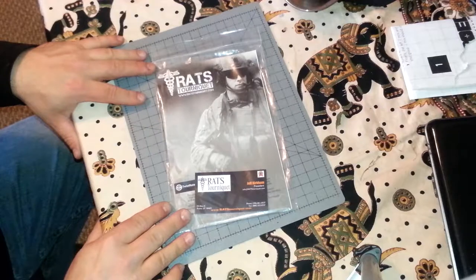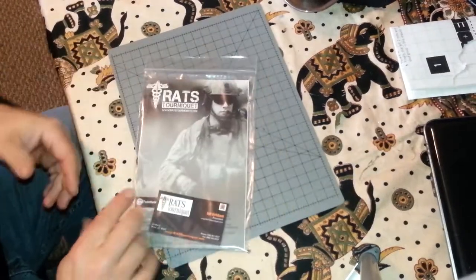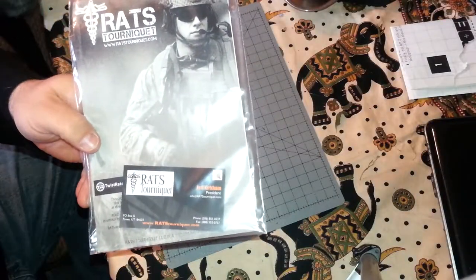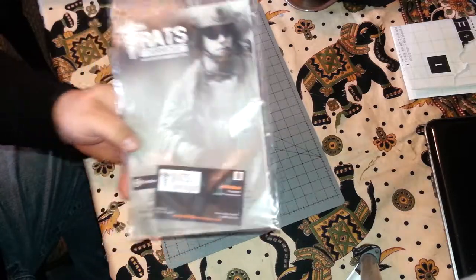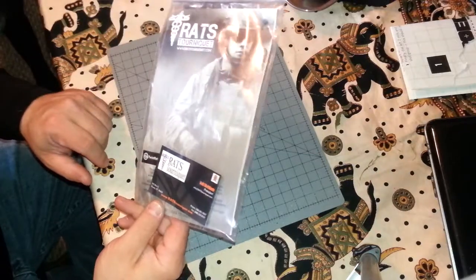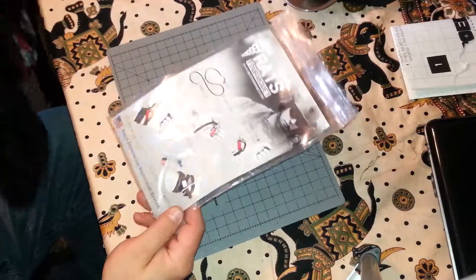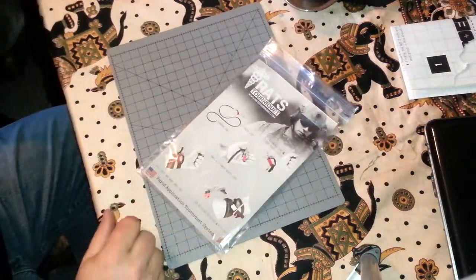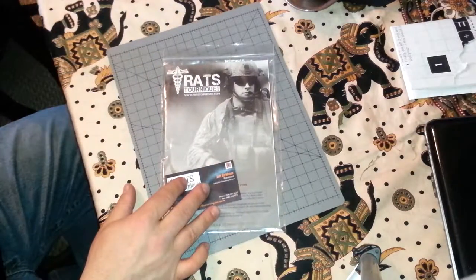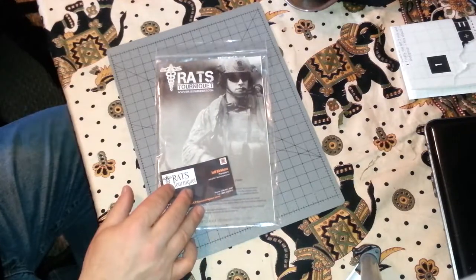I've been waiting patiently — I think three weeks, maybe slightly more — for this. You may not know what a RATS tourniquet is. It stands for Rapid Application Tourniquet System. These were originally done on Twist Rate, which is kind of like a Kickstarter or Indiegogo for tactical stuff — guns and whatnot.